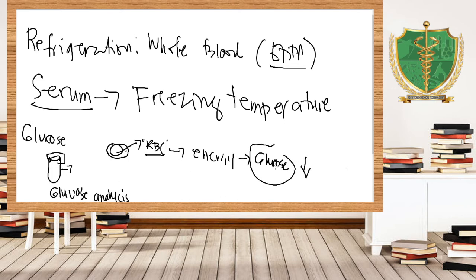And take note, pag na-metabolize ang glucose, nagkaroon ng glycolysis, bababa ang glucose. Eh, ang test mo, glucose analysis. Eh, kasi ni-refrigerate mo eh. No? Take note, kapag po mga gantong bagay, dapat po siyang i-freeze. Although, meron tayong mga tinatawag na cold factor and hot factor. Or, meron po tayong mga hot labile and cold labile. Most especially enzymes, no? Ang temperature, importante kapag kay enzyme. So, huwag nyo masyadong isipin. Darating po tayo dyan. Now, binibigyan ko lang kayo ng overview.